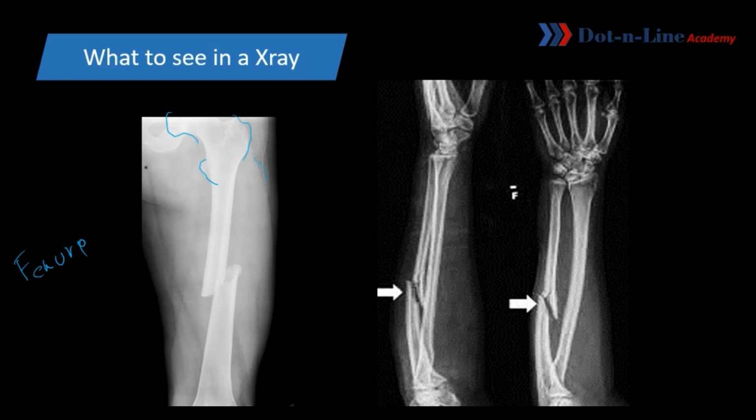The thigh area, this is a muscle. These are many muscles, you can see the linings passing. So what is the defect here? You can see it, alright? There is a fracture. We use the sign of hash for fracture. It is a fracture of shaft of femur.